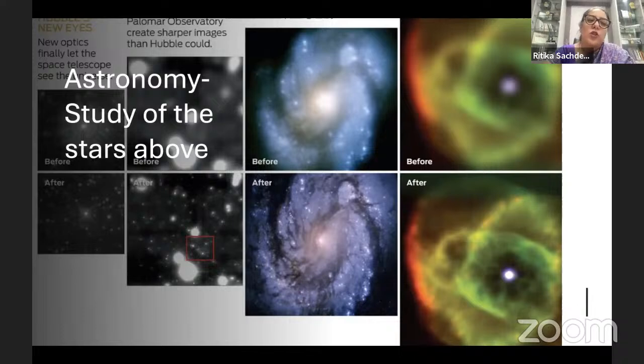It comes to us from astronomy, because when you had telescopes and you wanted to decipher the image of the stars, the light that comes in undergoes aberrations along the way because it comes through the atmosphere, and there are certain aberrations which are intrinsic to the mega optics of telescopes. So in order to create clearer visions of the stars above, we had wavefront help us.